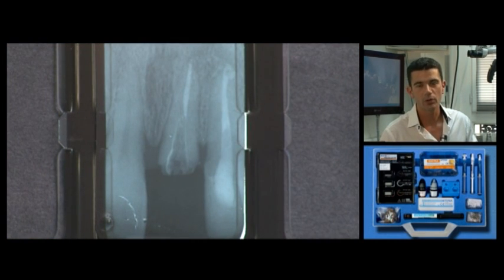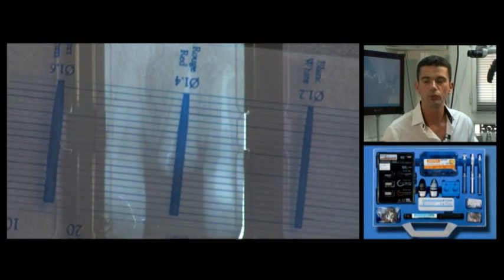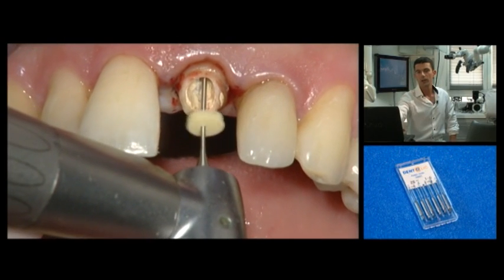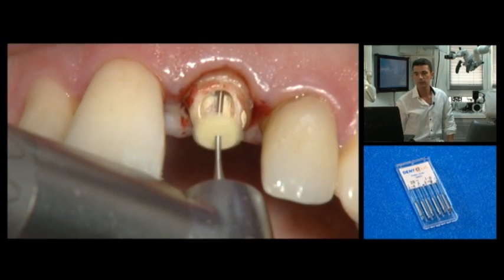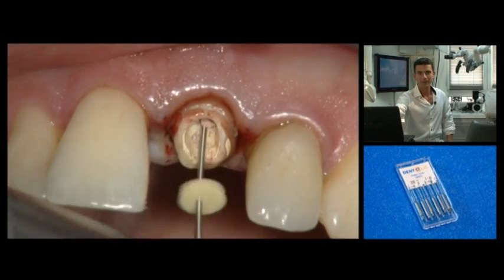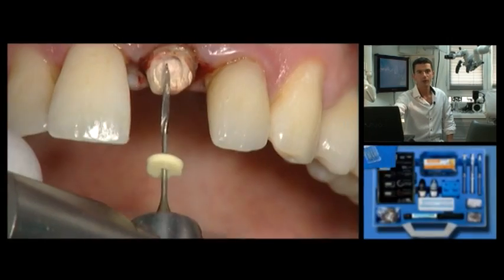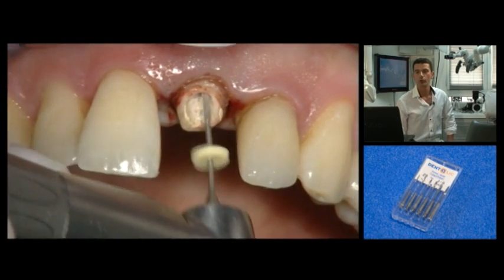X-ray analysis allows visualisation. A gauge is used to determine what length and diameter of fibre post to use. The canal obturation is removed with a gates drill. The length of work will be predetermined and maintained until preparation of the canal is complete. Next, a largo-type drill is used to shape the canal mechanically.